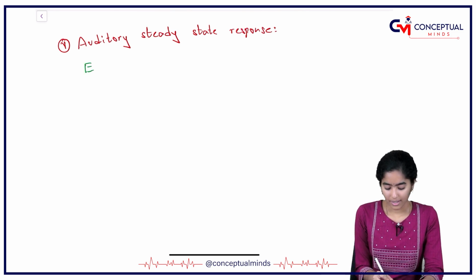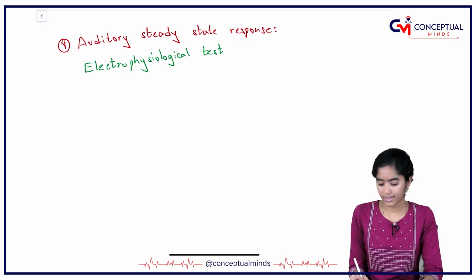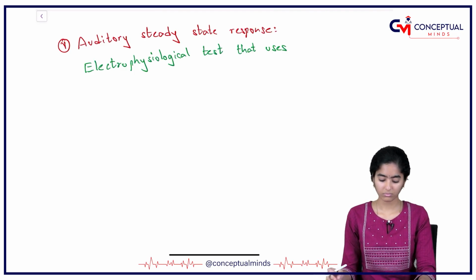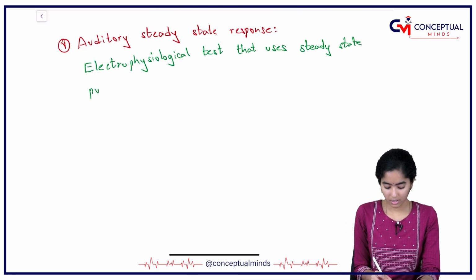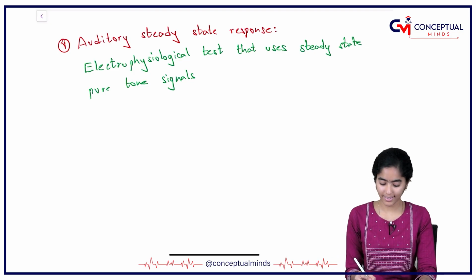So this is an electrophysiological test that uses steady state pure tone signals instead of the transient signals that are used in BERA.